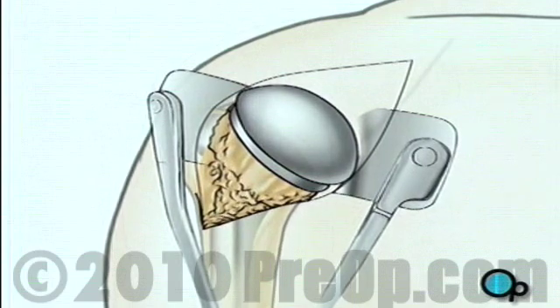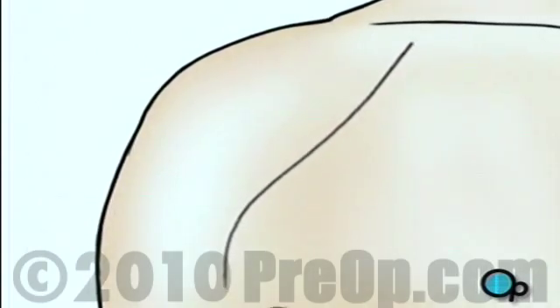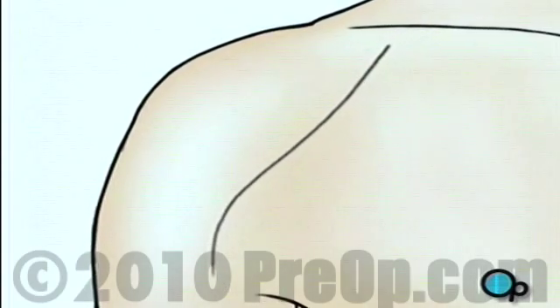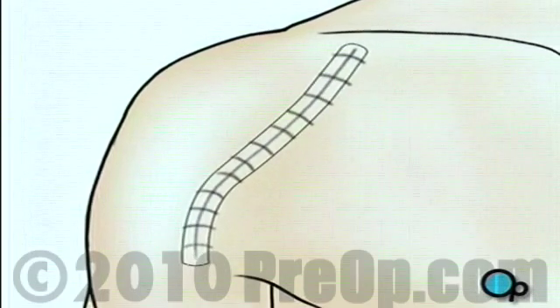Muscle and other tissues are closed over the joint using dissolvable stitches. A temporary draining tube may be added. Finally, the skin is closed with sutures and protected with sterilized strips.